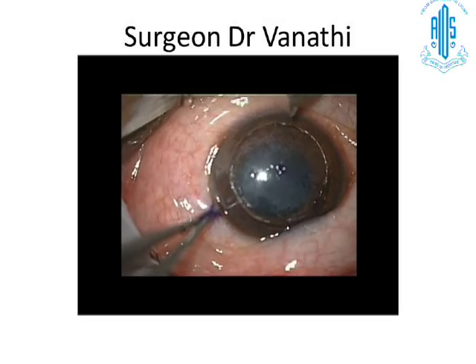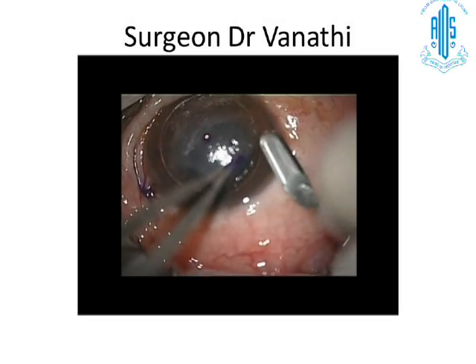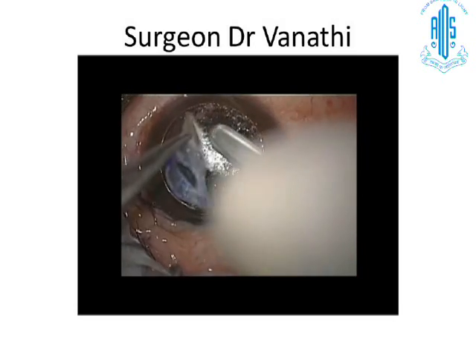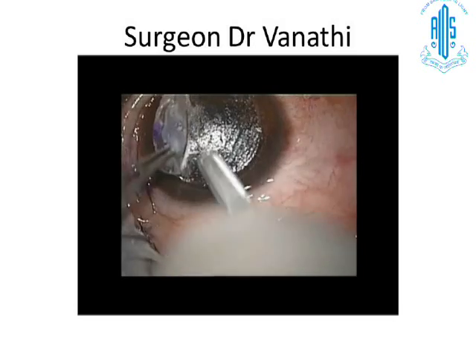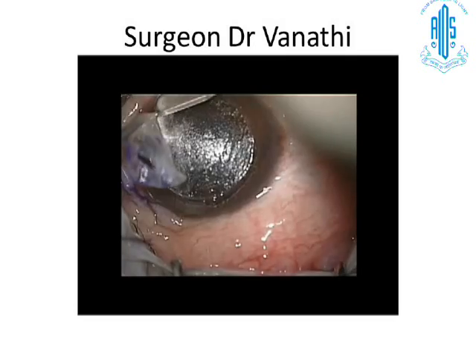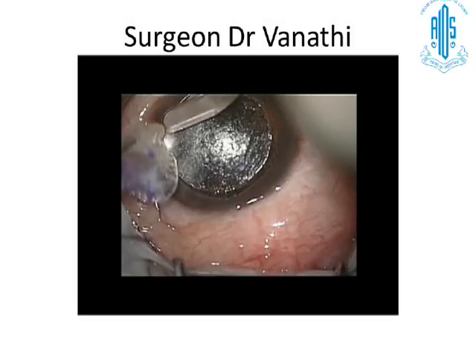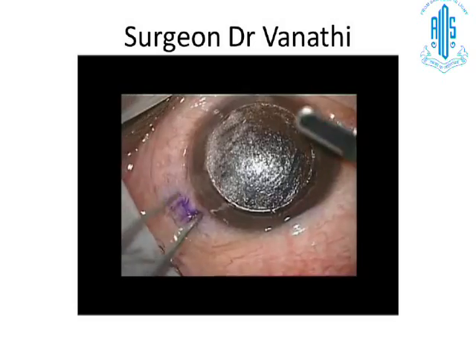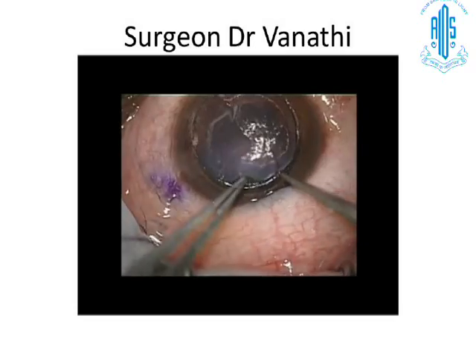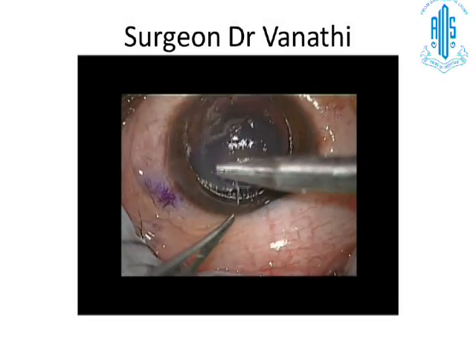Generally it's easier to do the open technique. Ma'am is extremely experienced, so she is comfortable with the closed technique, but it can be a little difficult to do a closed technique. So if one is a beginner, open technique is much safer, and you just go to the depth. The other thing is, when you're dissecting such patients, there is a little haze created by the stroma, so you get confused whether you have really removed the whole opacity or not.